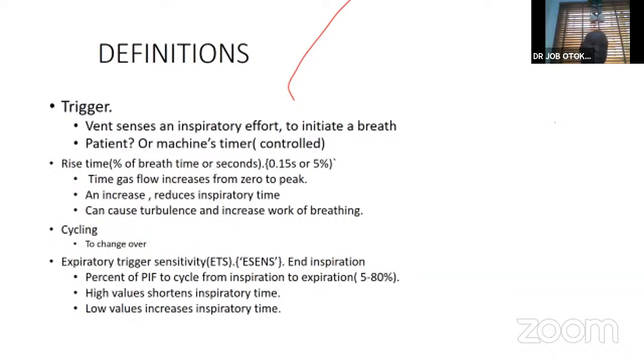Another thing you hear about in mechanical ventilation is cycling. Cycling means you're changing over from inspiration to exhalation. That changeover is what they call cycling. So it could be pressure cycling, it could be volume cycling, all of which we'll discuss later.